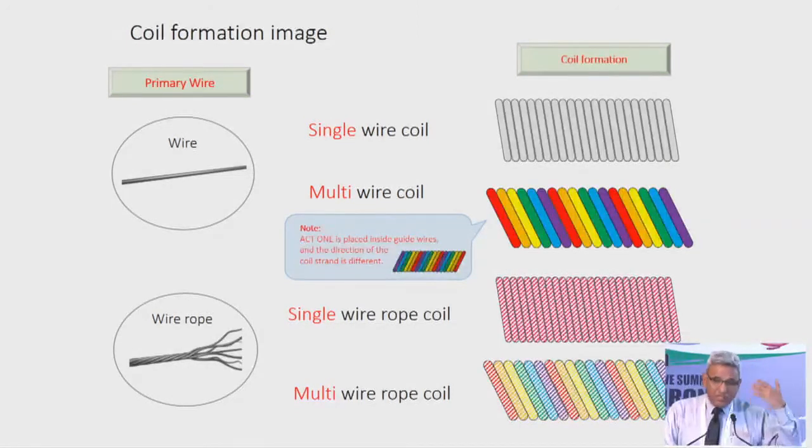But sometimes, like it was explained by Dr. Goyal, all of us who use Gaia wires have sacrificed Gaia wires, because especially when there has been calcification, these wires are like Abhimanyu. They can enter a lesion, but when you try to remove them, they actually break. And this especially happens if you use any amount of torque to get them into a lesion.